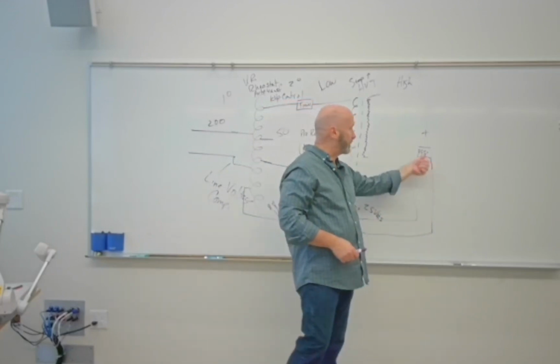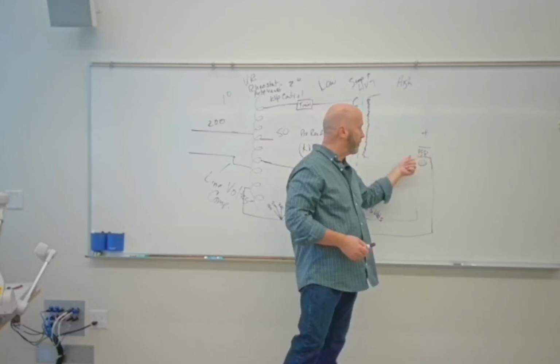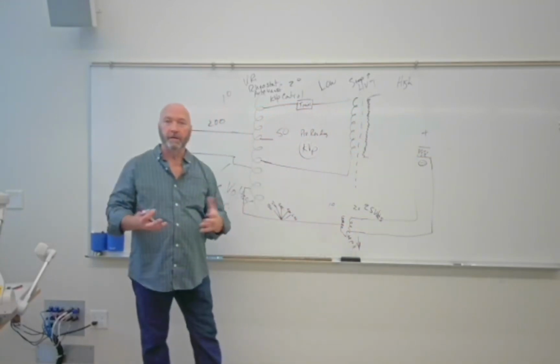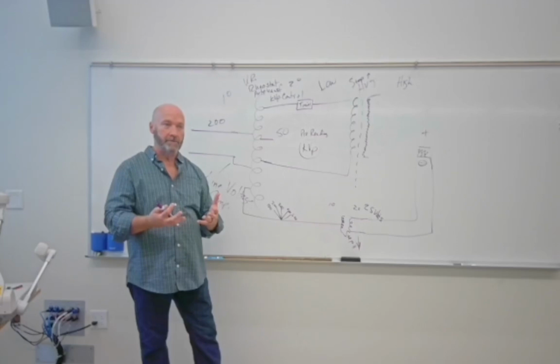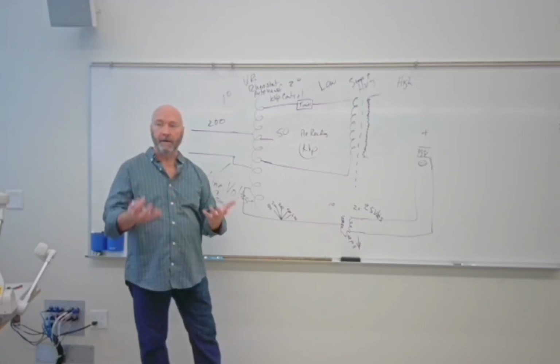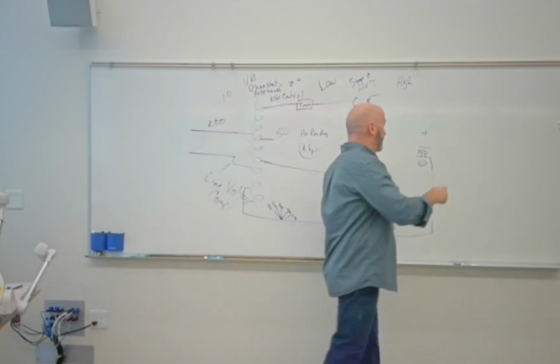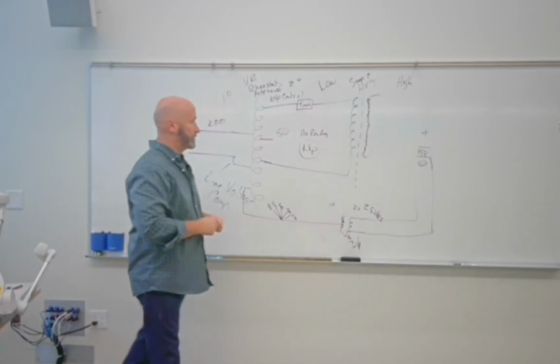So we run a low voltage current through our filament to create a space charge, a whole lot of electrons. We heat it up, create a whole lot of electrons: space charge, thermionic emission. We don't get our exposure until we energize the second half of this other circuit.